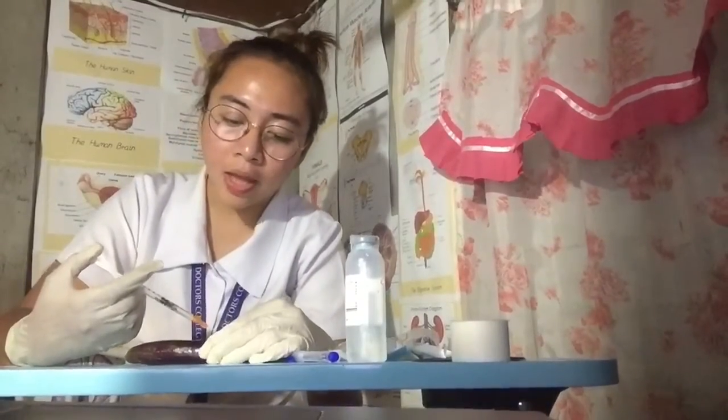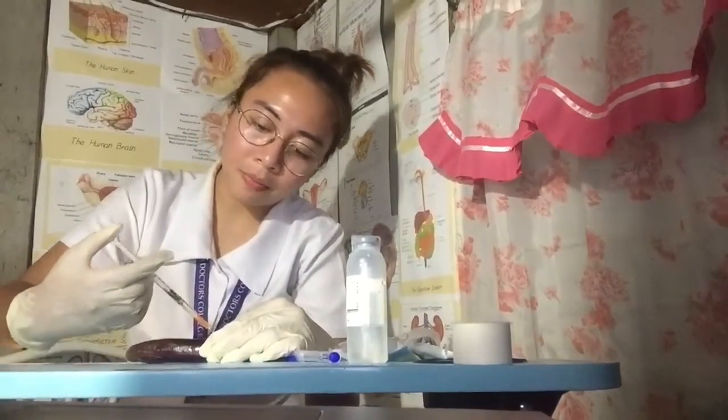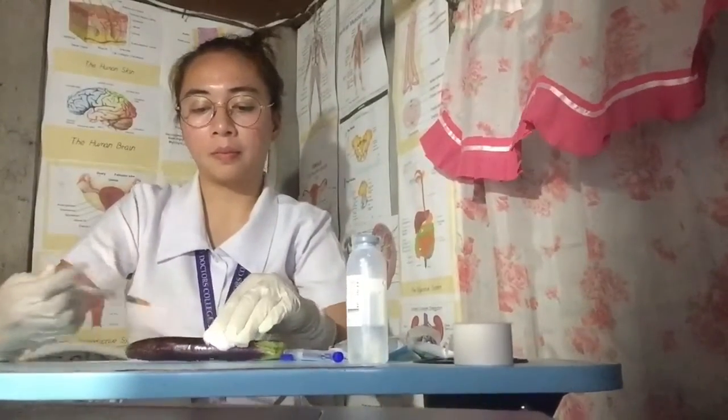Now I'm going to insert ko ma'am. And now inject the medication by holding the syringe steady and depressing the plunger with slow, even pressure. And now let's push it. Remove the needle. And get the cap.